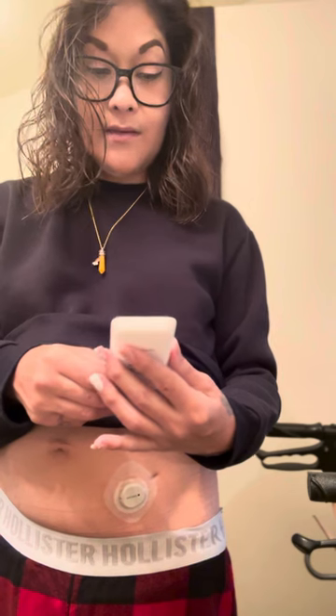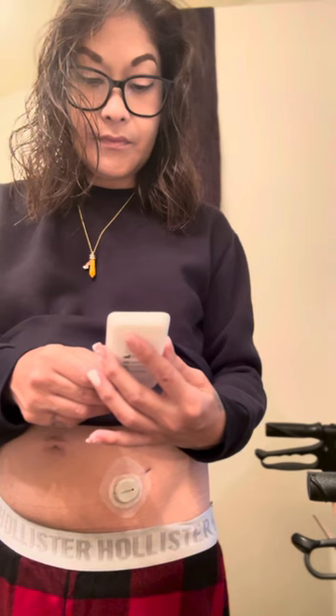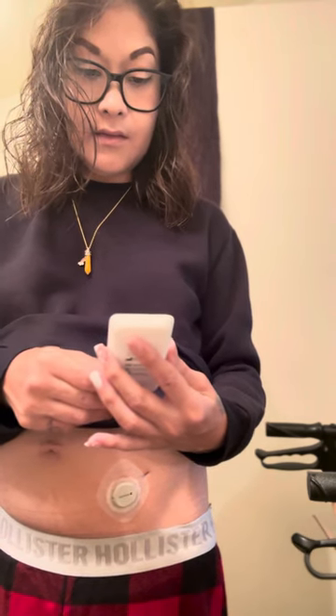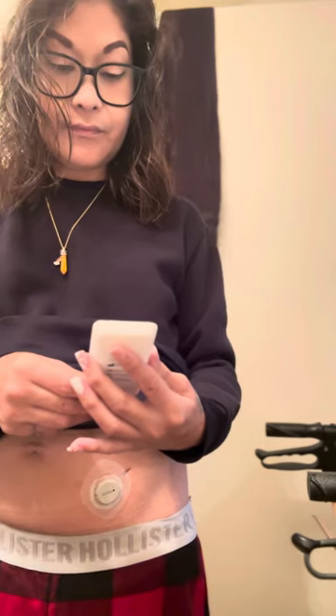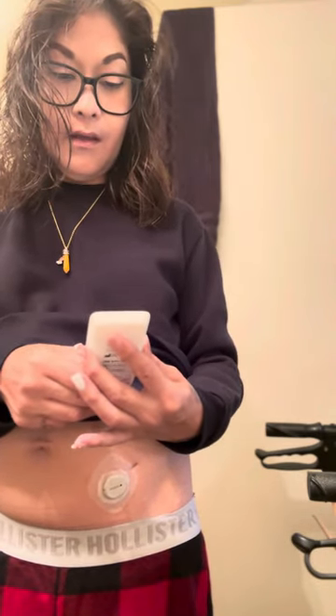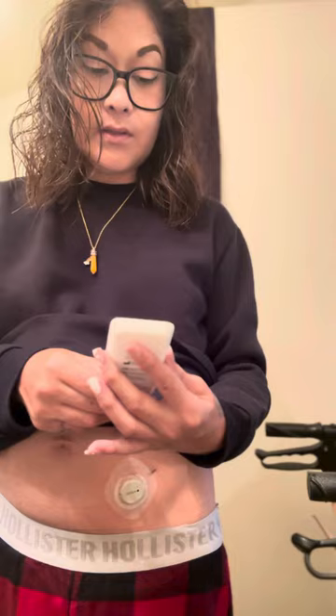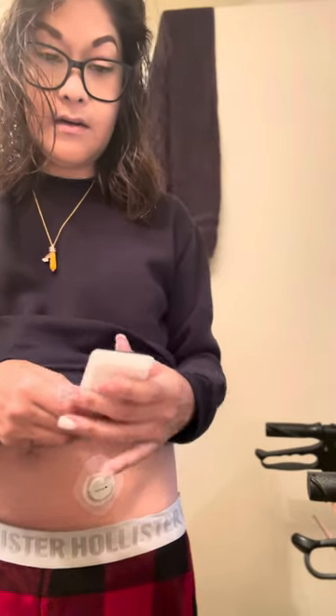I thought that was pretty cool. Then you just hit menu and go back. It says your sensor is now warming up — no sensor readings or alerts until warm up is done. That is pretty cool.